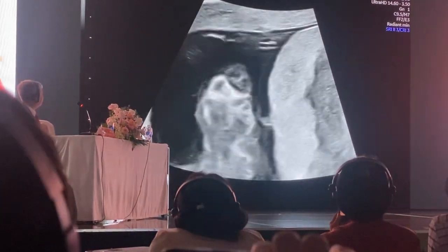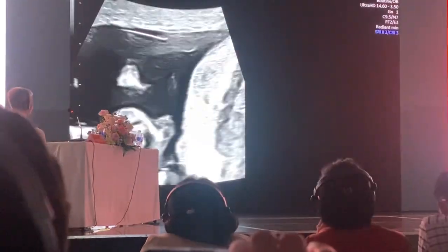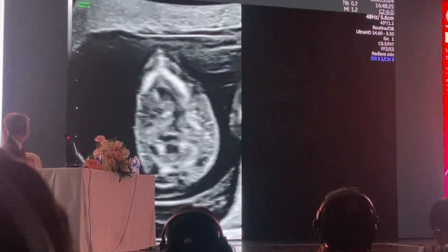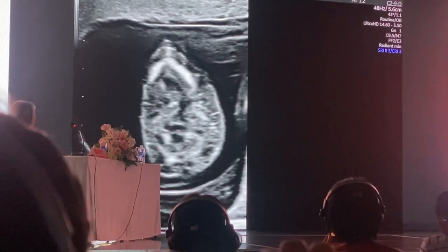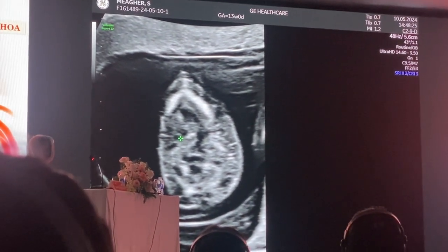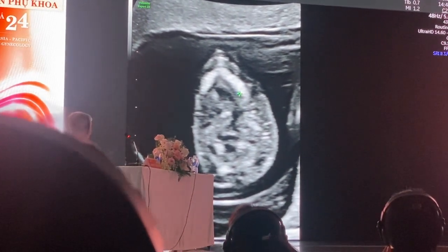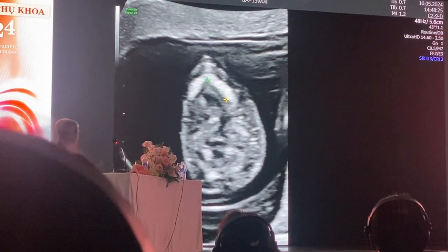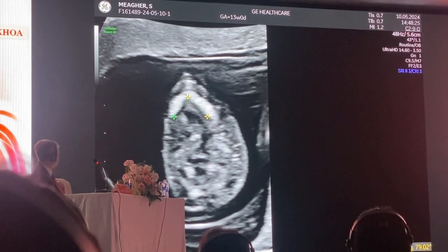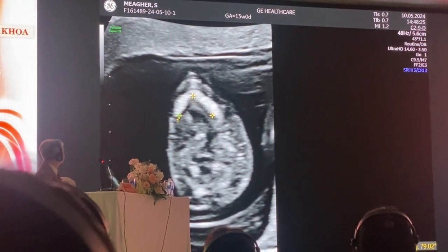In terms of looking at the baby's face, I'd like to produce an image showing the mandible. So I'm going to split the image, and it's going to bring into view the mandible. Now the mandible is quite an acute angle bone, and I'll tell you what I mean by this. You take a generic angle, and if you look at this angle to come to this point here, and look at the angle of it. It's really quite a tight angle. It's almost sort of 79 degrees. And that is the mandible. It's a very narrowed angle bone.